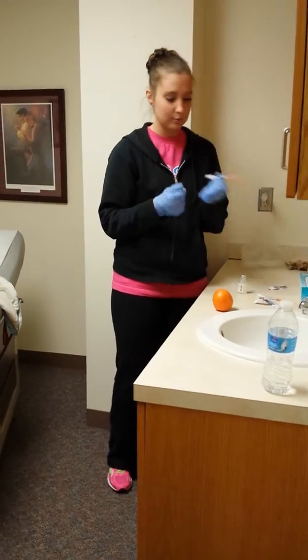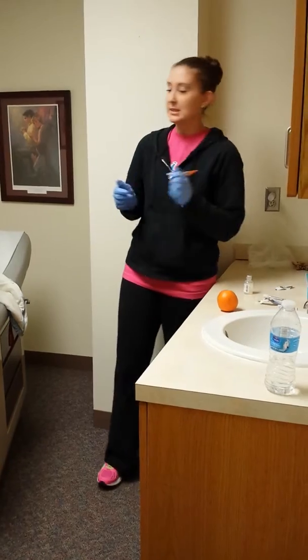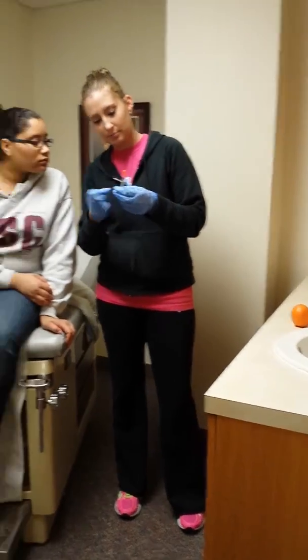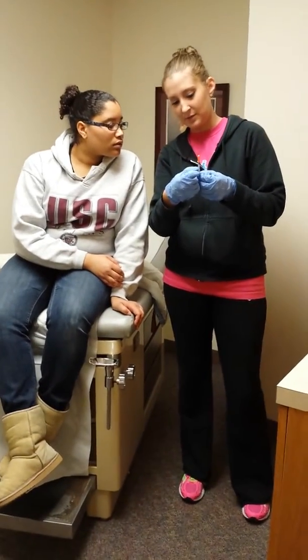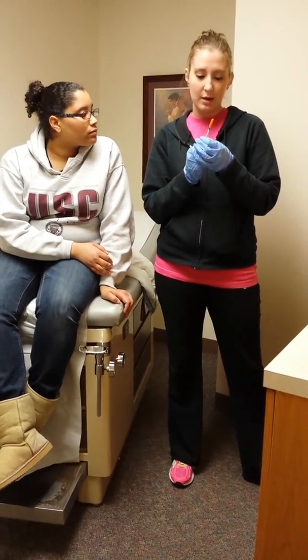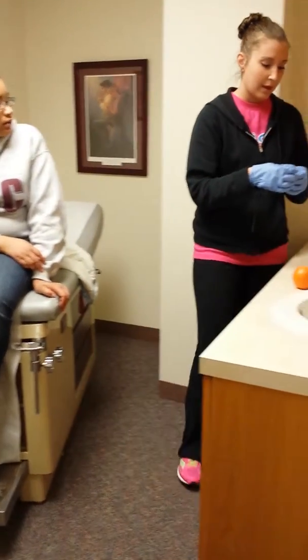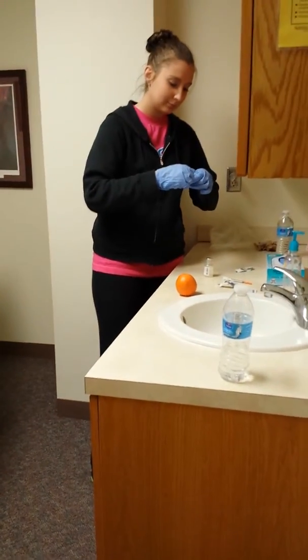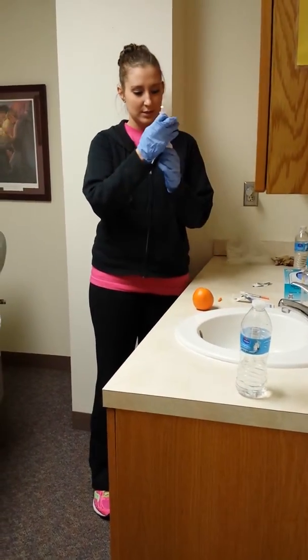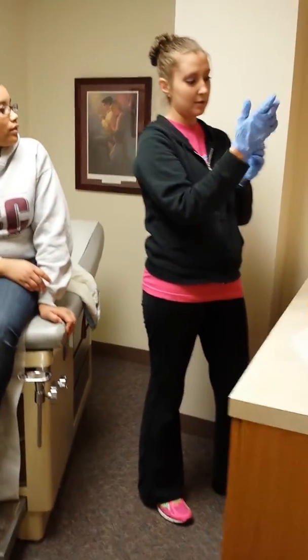Then you have a brand new needle — take this off, just pop it off. We're going to say that you need to give yourself five units of insulin. You can see how it's all marked: five, ten, fifteen — it goes up to fifty. You want to put air into the vial equal to how much you're going to draw — so five units. Then take your lid off, be careful you don't stick yourself. Stick it in straight down, then push the air in.